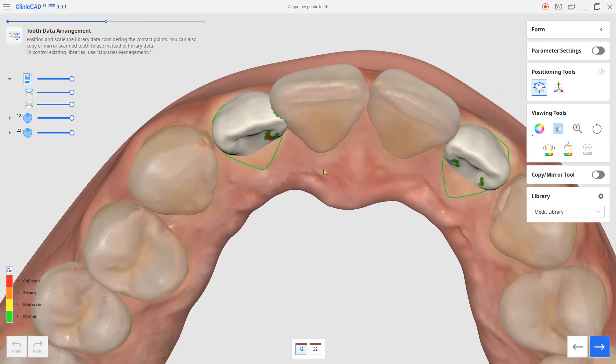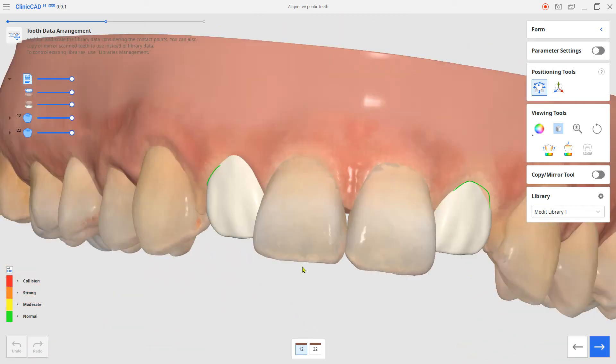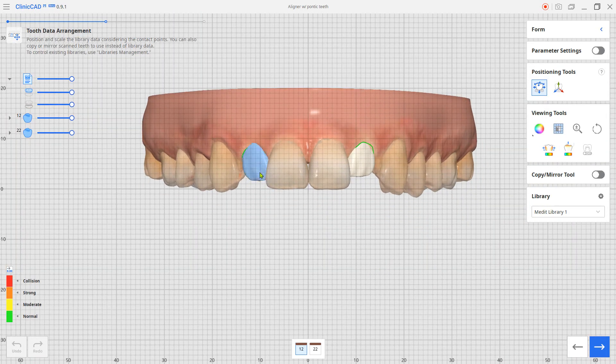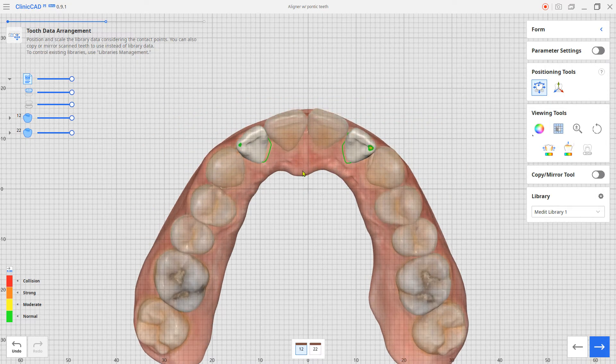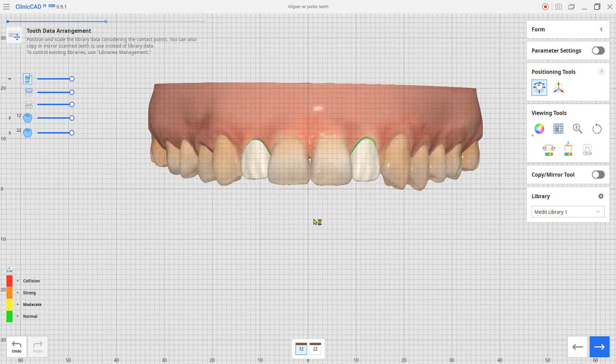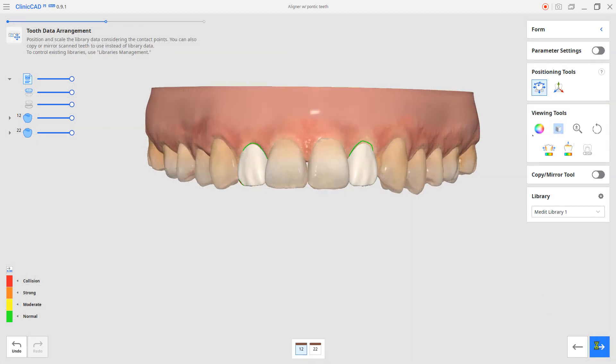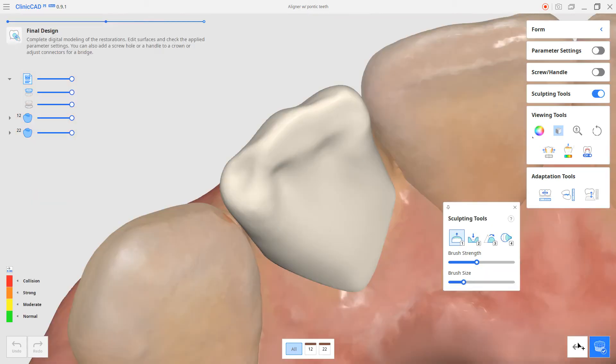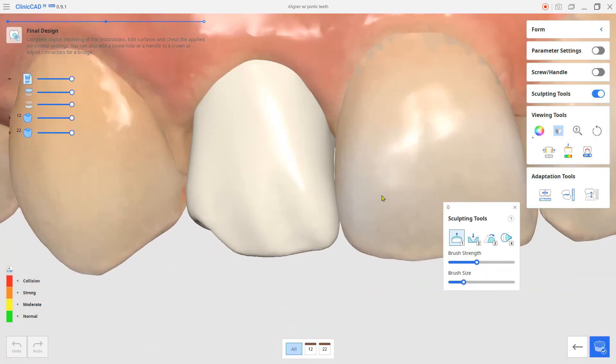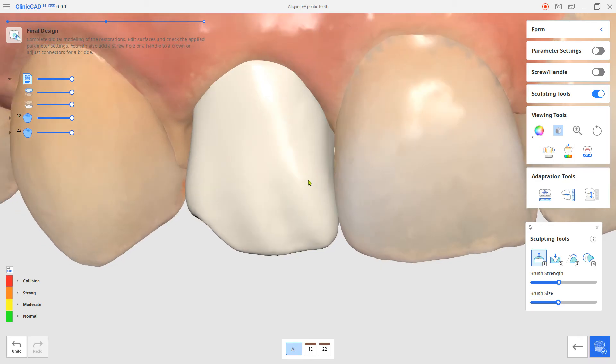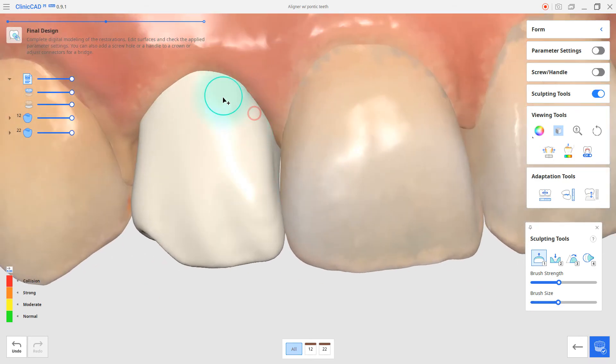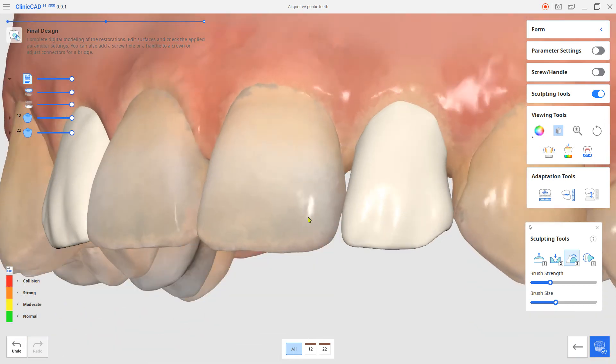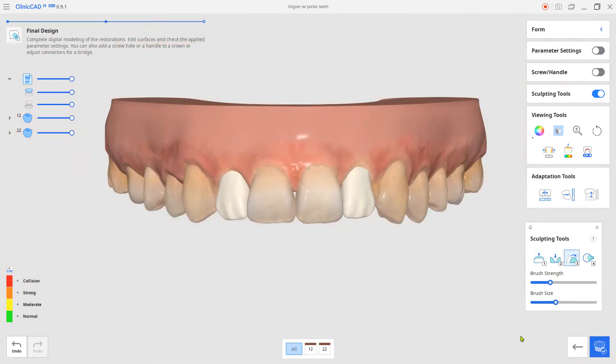Adjust the teeth position and size. Adjust the shape if needed. Click complete to save.